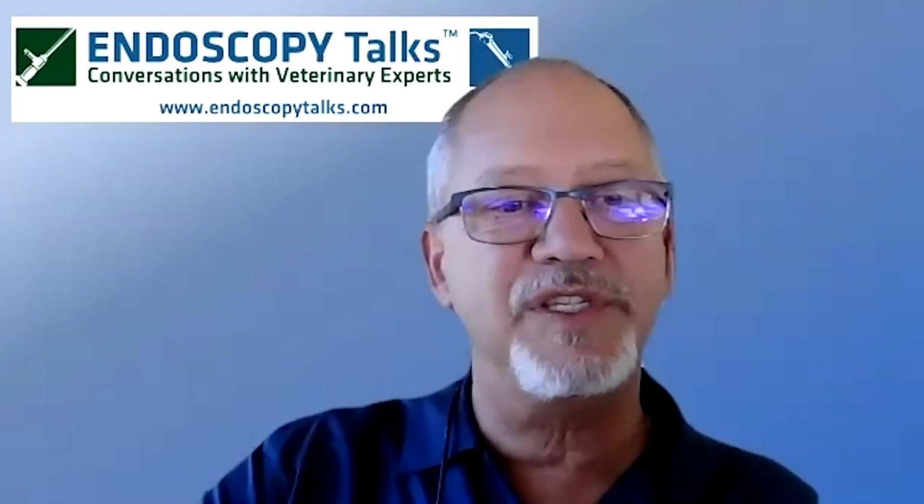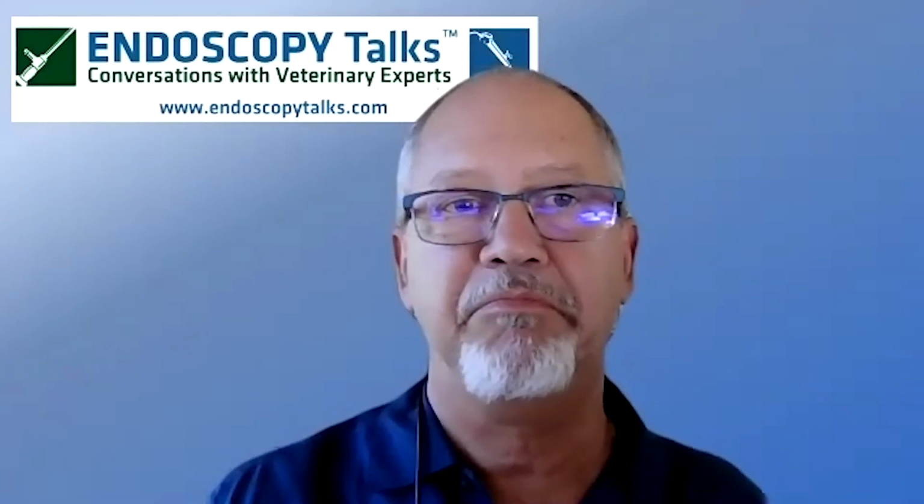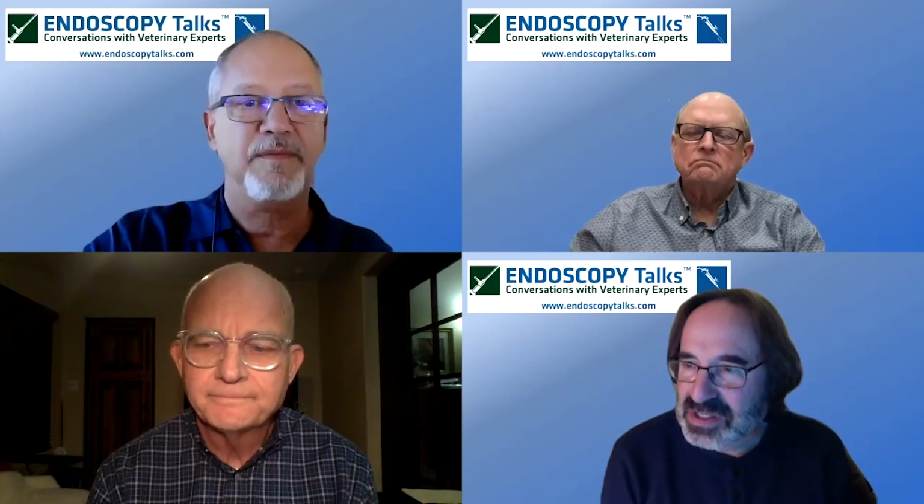Okay. How often do you suspect underlying GI pathology and possible indication to take biopsies? I think that's a really good question. Historically, if the animal is not presenting with chronic vomiting or chronic diarrhea, I take the foreign body out, and I do not take a full diagnostic series of biopsies in that instance. I don't know about the other panelists. Yeah, I agree. Rarely would I do that.